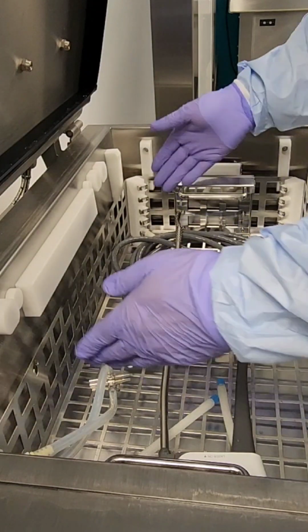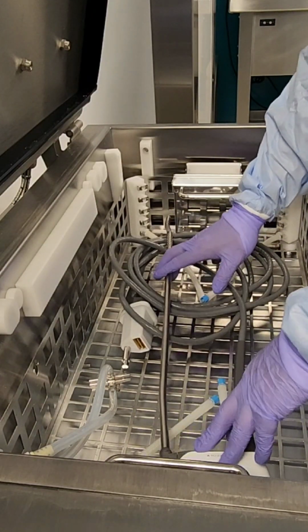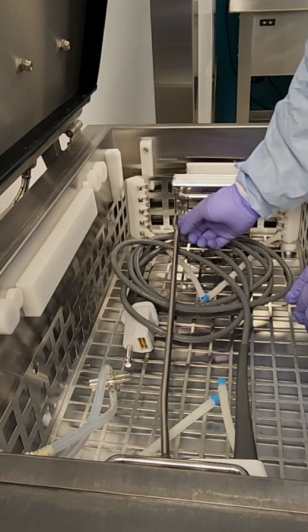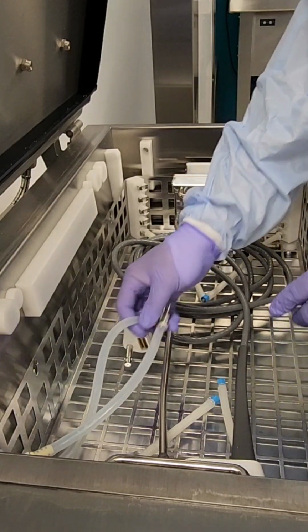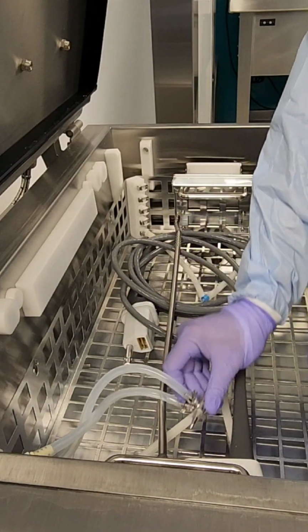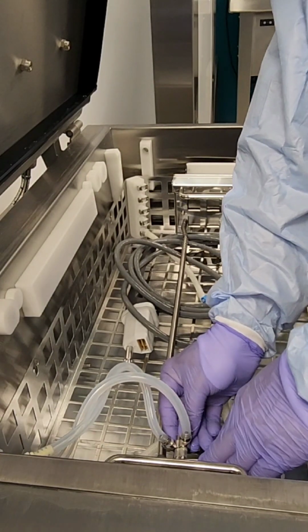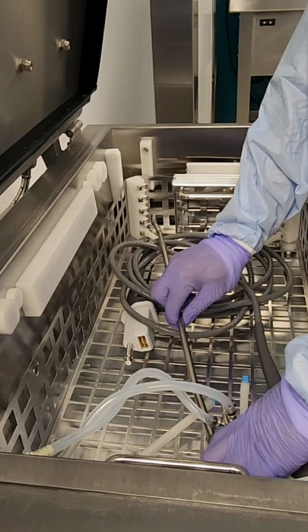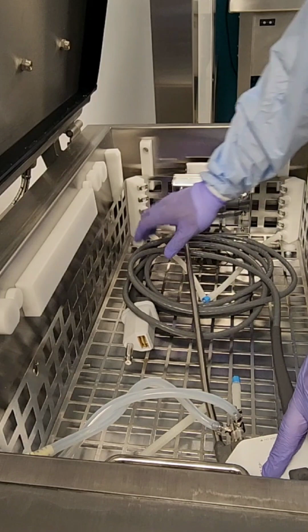Okay. One thing to note is that for the Da SP cameras, you ultrasonic one camera at a time. Lay it in the bottom of the basket, and then connect your port adapters, right? And make sure that they feel snug and that the camera is not going to be flying around or moving around in there, causing any damage from the ultrasonic.